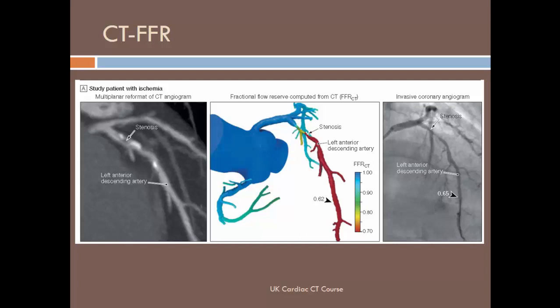I would say, you could get a stress echo done for 300 pounds or something like that. Why do you want to spend 1,200 pounds of taxpayers' money doing this technique? But if it is cost effective, then I think this technique can become very useful in clinical practice. The number of patients who will require this technique is maybe 15 to 20%.